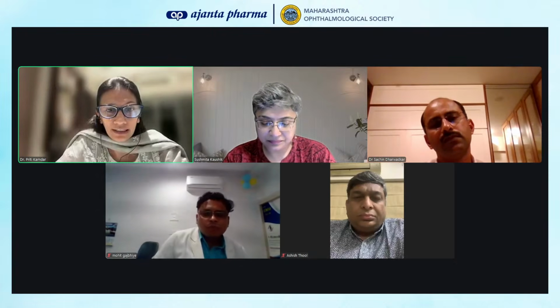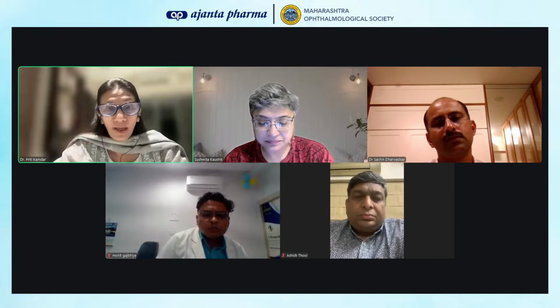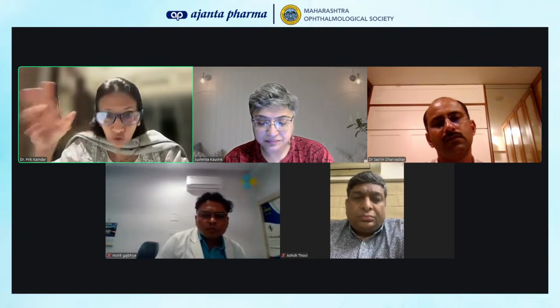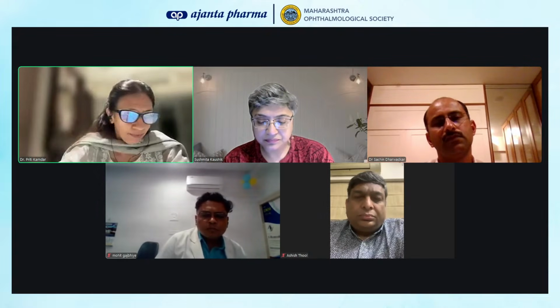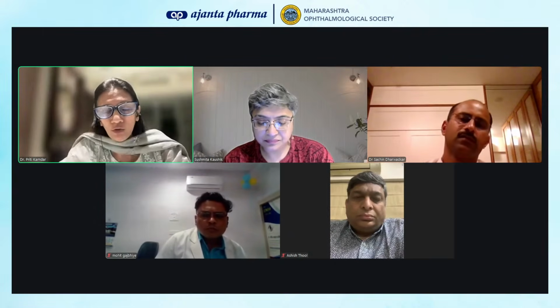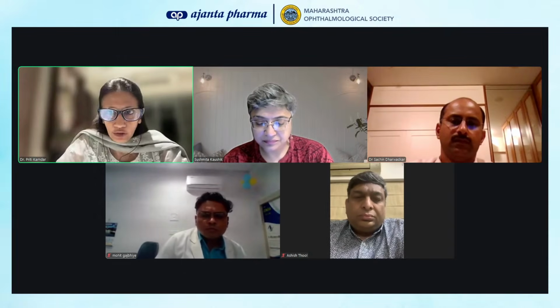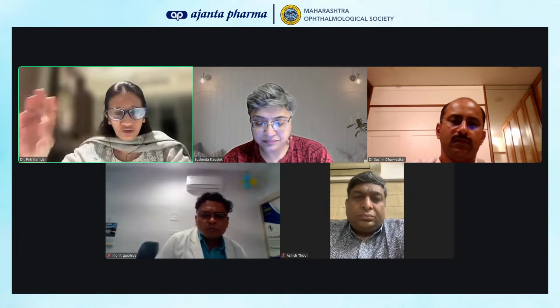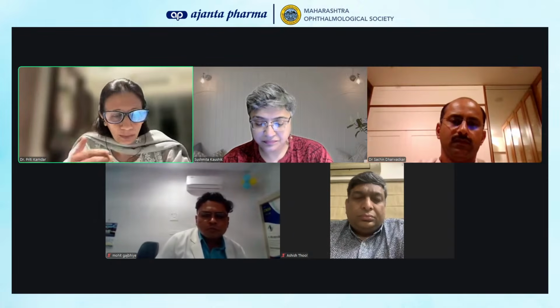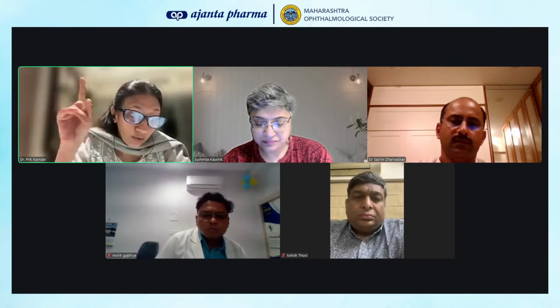As Dr. Sachin has said, know your machine well, know where it fails, where it helps. Each machine will have its strengths and its drawbacks. Talk to the people who use it, and also the company people. They will only tell you the positive points, but the competitor is going to tell the negative points. So when you're looking for machines, talk to different people and try to find out the pluses and minuses of the machines.